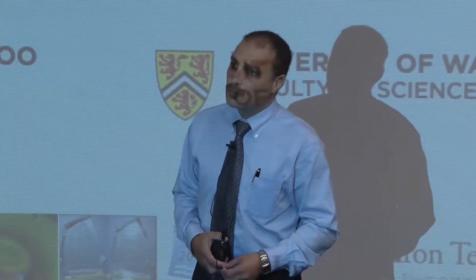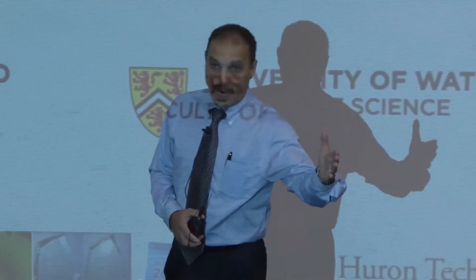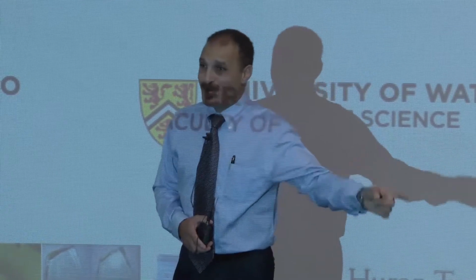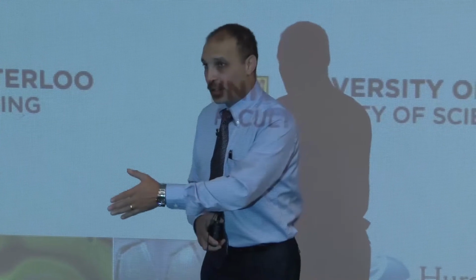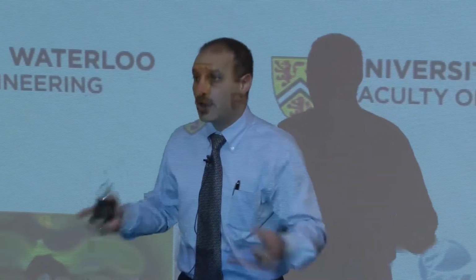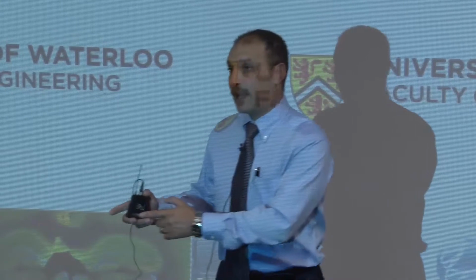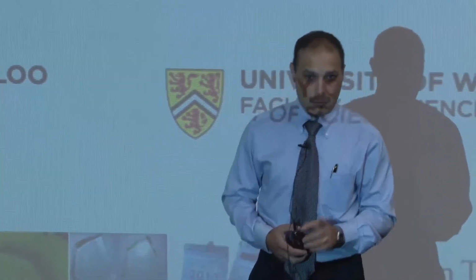So just quickly, if I understand correctly, your sensors are in the range of infrared and digital? The detection happens all the way from 400. Sometimes we excite with 380 and we image in the 400 nanometer. And when we excite with 700 or 650 or 800, we have to have detectors. For the fluorescence, we use photomultiplier tubes that have a very wide range, and we select the ones that are targeted in that band of the spectrum that we image. So it is flexible. We have multiple choices. I think that was one question.